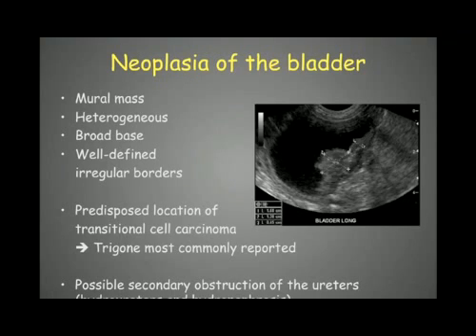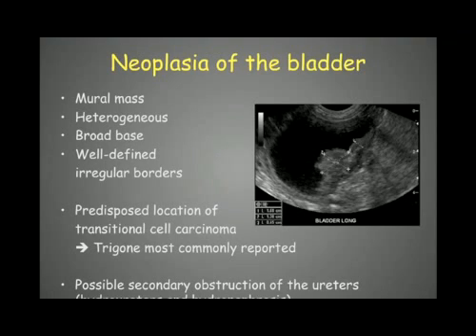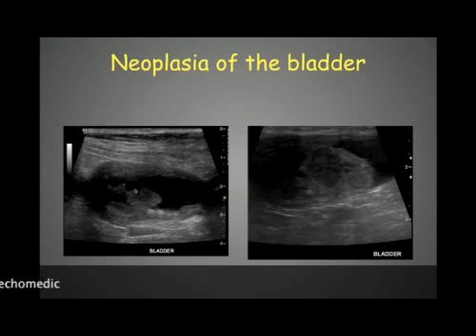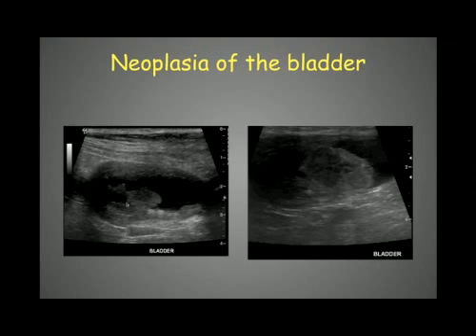Here is one example of transitional cell carcinoma taking up the complete dorsal wall of the bladder. When the neoplasia is at the level of the trigone — at the entrance of the ureters — we can have secondary obstruction of the ureters, leading to hydroureters and hydronephrosis. Here are other examples of bladder neoplasia showing well-defined but slightly irregular surfaces, always attached to the wall with a broad base.